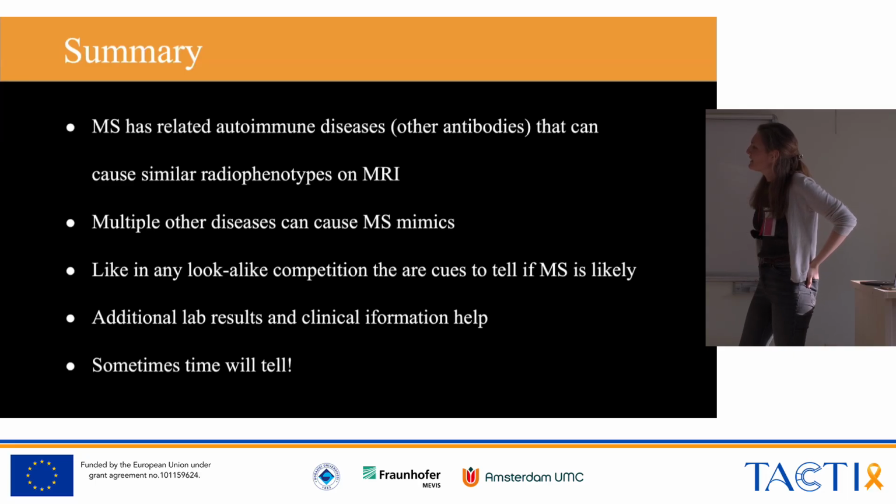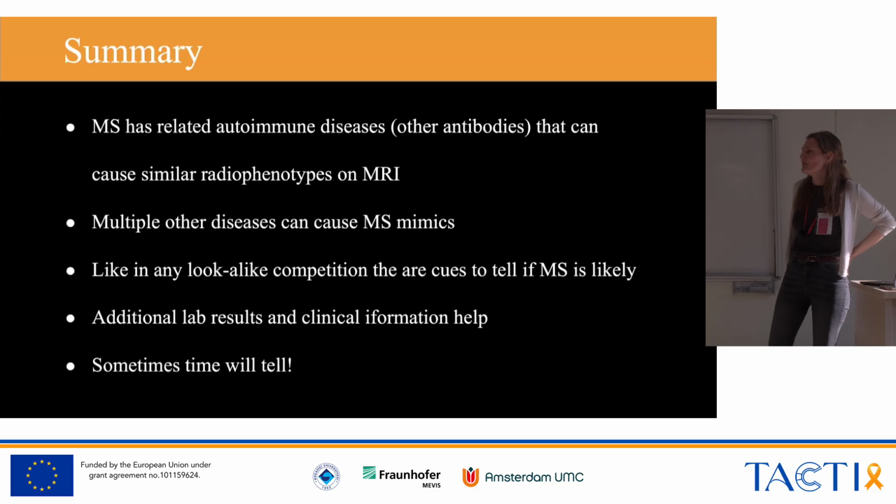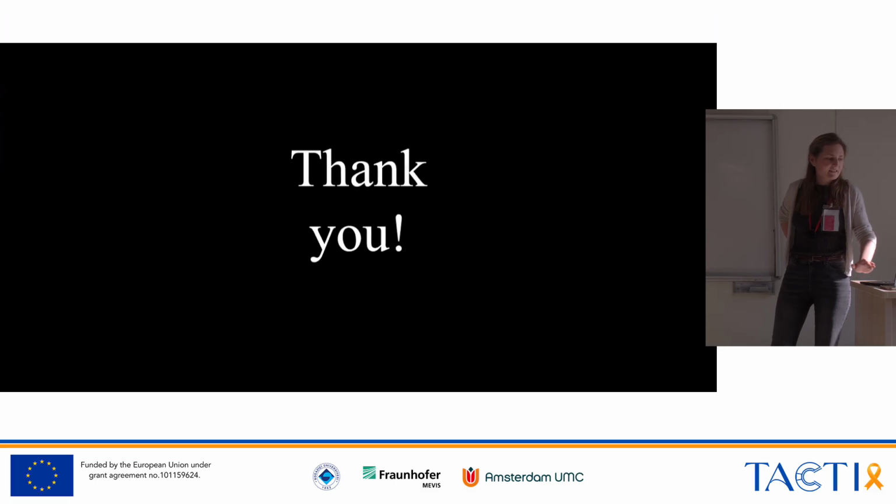And there are many other mimics, and we have an interdisciplinary meeting twice a week where we discuss those patients who have maybe MS, maybe not, and sometimes it's very difficult. And with that, I'm already at my last slide, and I think we're well in time. We are on time. Yeah.